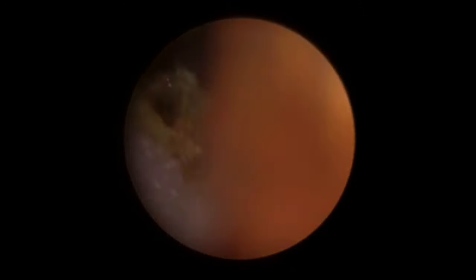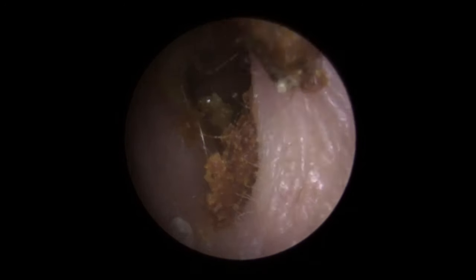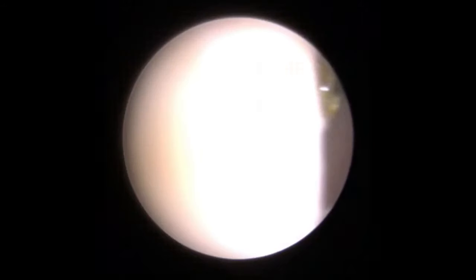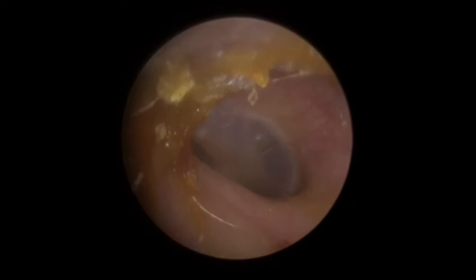This is more than likely going to be slightly harder when we get to the deeper section — it may have been here a little bit longer. You can see the colour change now — we're getting to that far darker chestnut-y brown colour. There we go — you can see it's all coming away really nicely. We just need to tuck behind this section. Similar to what we were doing on the first ear with the left-hand canal wall — you can see we get a lot tucked in just around the corners. I've got a bit of dry skin there — take that away.